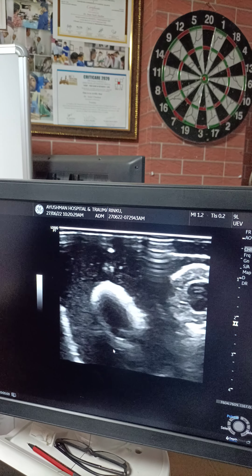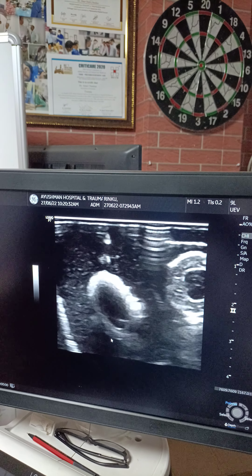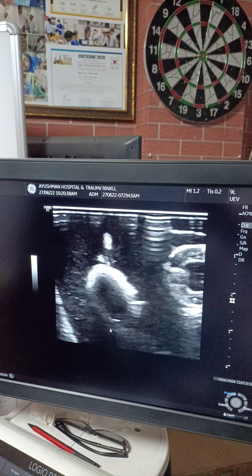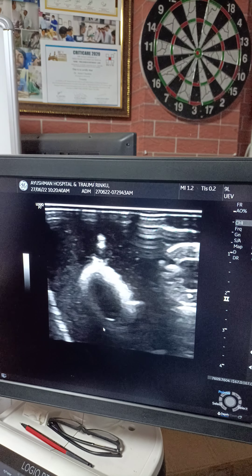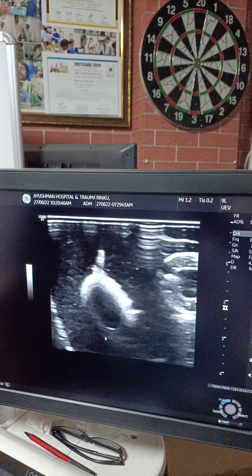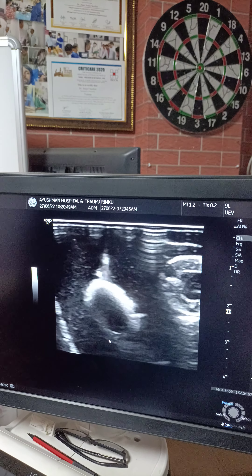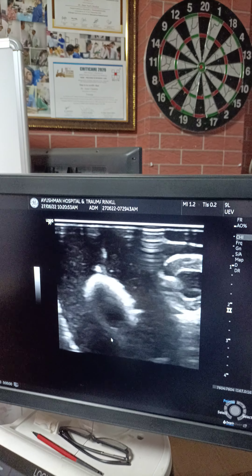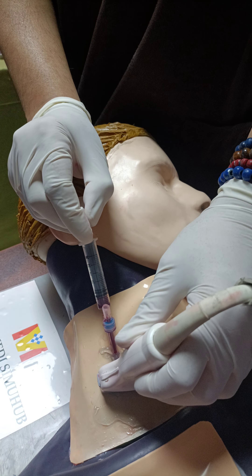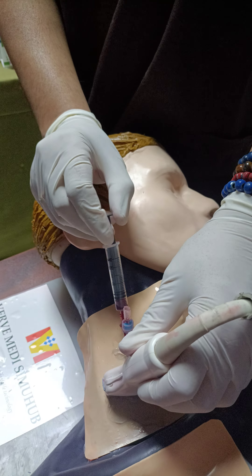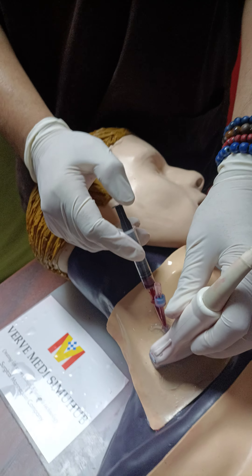With the needle in, slide your probe as you advance the needle — small micro-motor movements — keep advancing the needle, keep sliding the probe. Now you are touching the vessel wall, then you enter the lumen and get a give-like feeling. What you then get in the syringe is blood, and that is what a candidate needs to learn — don't assume, see the blood inside the syringe.